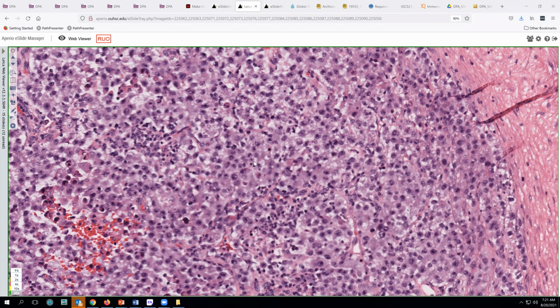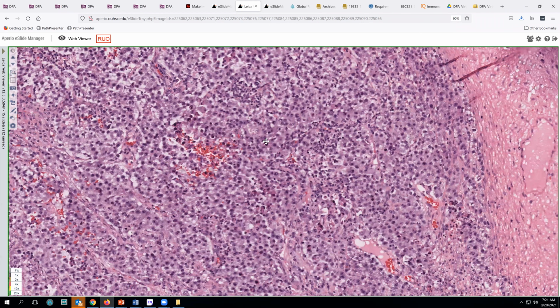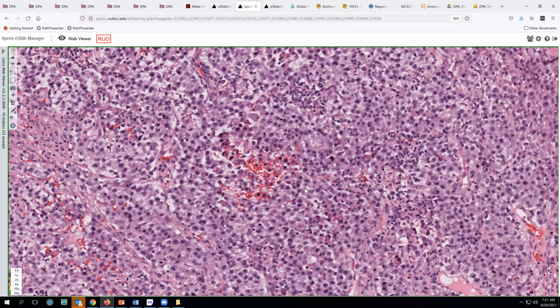There was a little bit of cytokeratin expression, which would be a little bit unusual for dysgerminoma, but there was some expression. The cells were nicely positive with PLAP, with OCT3/4, with SALL4, and they did not express CD117. Excuse me, no. They were positive with CD117, but they were negative with AFP and with CD30, which we would expect if it was an embryonal carcinoma. So our final diagnosis in this case was dysgerminoma.